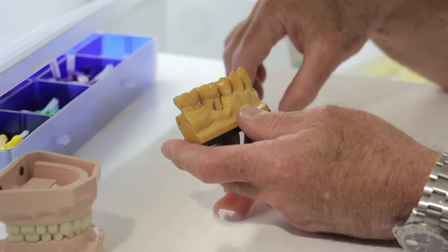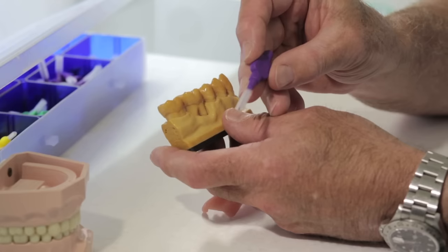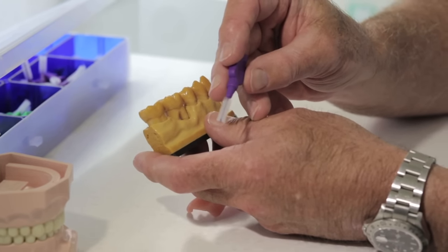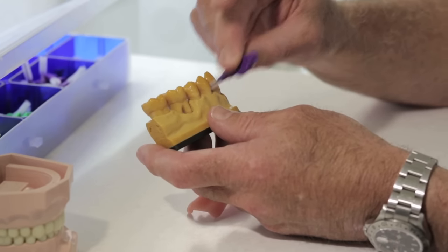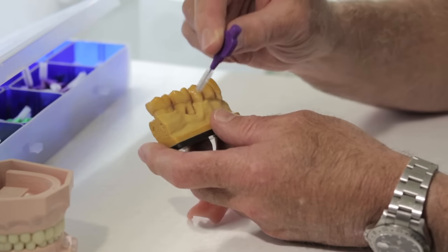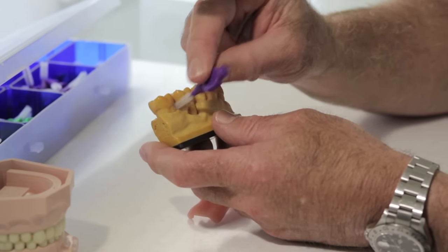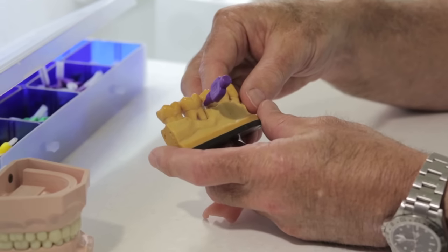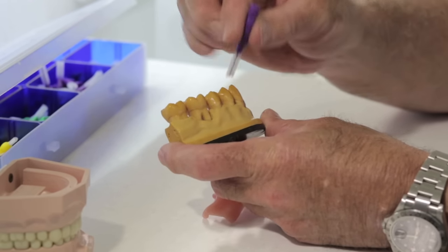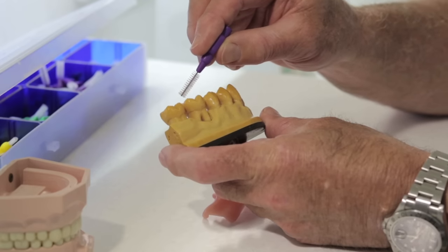So how do we use TPs? TP is a make of interproximal brush — there are many others, this just happens to be the one I like. It has bristles on it and it's very good for cleaning in all the gaps, cleaning the bulk of the bacteria out. It can't be used instead of floss; it has to be used as well as floss, because it just cleans that triangle out, not where the teeth touch each other.